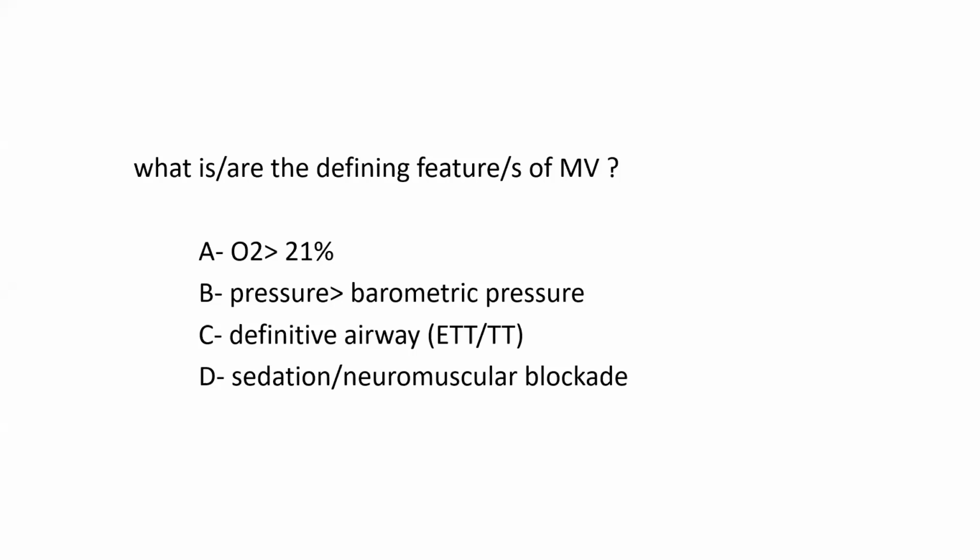Sedation. Can you ventilate a patient without sedation? Yes, if they're highly cooperative on invasive mechanical ventilation, but more commonly on non-invasive mechanical ventilation, you would ventilate a patient without any sedation. Can you ventilate a patient without a definitive airway, endotracheal tube or tracheostomy tube? Yes, again, on non-invasive mechanical ventilation. And obviously, none of you chose A, which is oxygen, because if the patient does not have any problem with oxygenation, then you would not necessarily add any oxygen above room air.